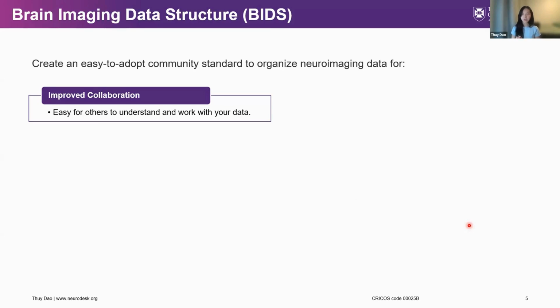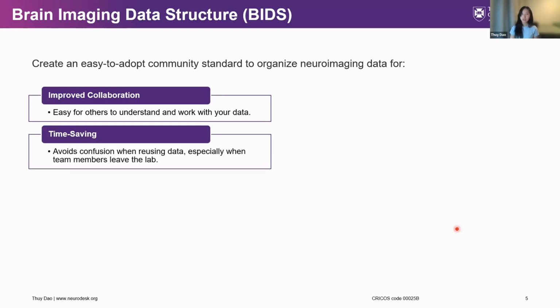This is very helpful when you work with multidisciplinary teams or across institutions. It also saves time making sense of old datasets, especially when the team member who collected the data is no longer around.